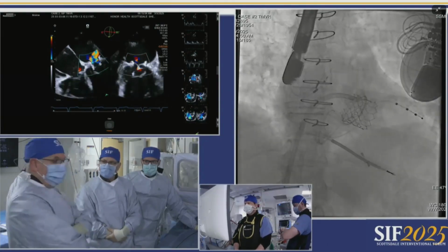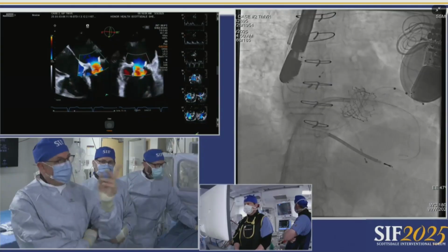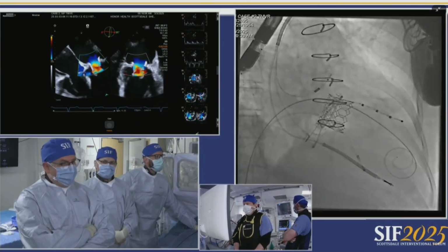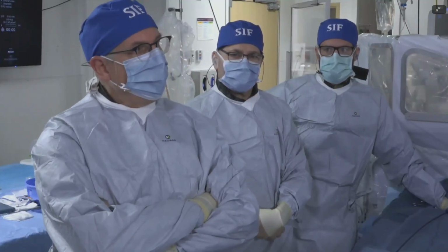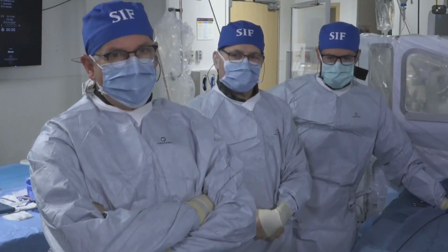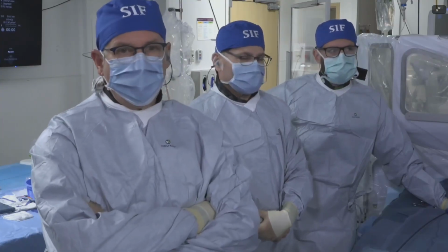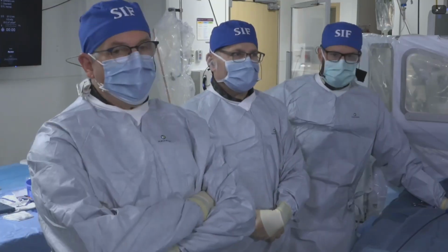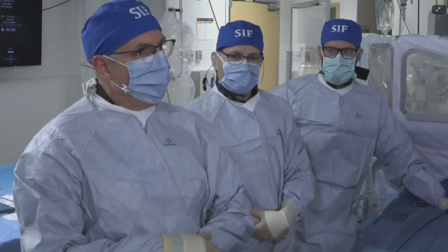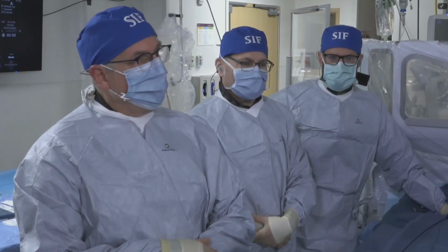Yeah, so just to maybe hand it over to the panel, but essentially we have a very rigid ring. I think in some ways they were very fortunate to get a good result at the original procedure. Felt to be a high-risk patient for another procedure. I don't think anybody thinks this is the ideal situation for managing this problem, but from the clinical history, it seems like really one of the only options that is left for her at this particular junction. So we've given it a lot of thought in terms of how to manage it. There's previously a 26 in there, so we elected to go with a 23. We know that ring is not going to give, and so the final decisions are really with the 23, how to position it.